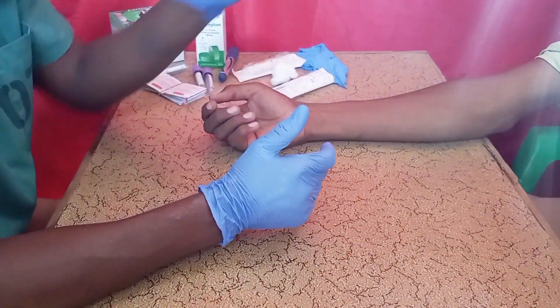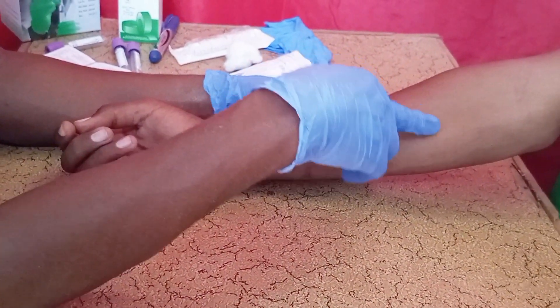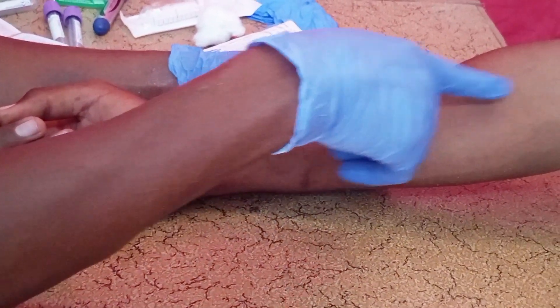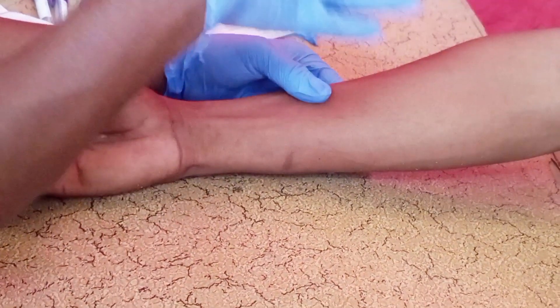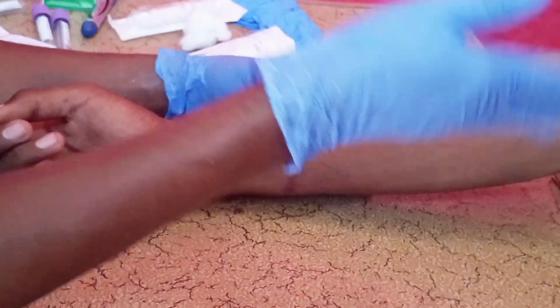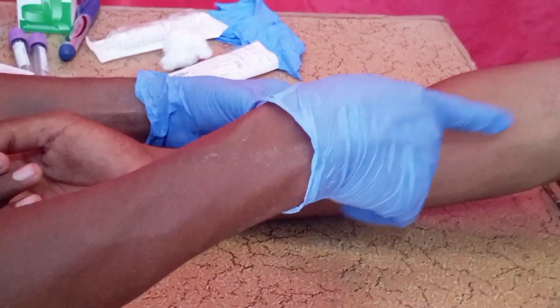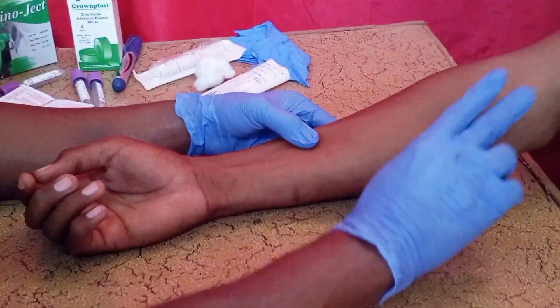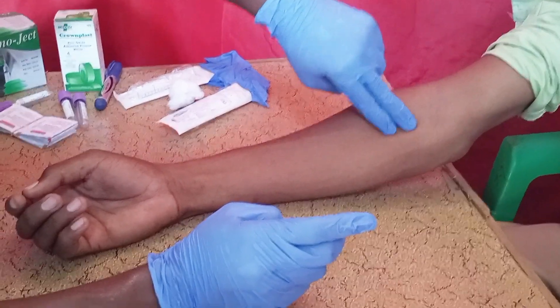You have to select the best and suitable vein. Generally, when taking blood we always select the antecubital vein. As we know, we have the basilic vein, cephalic vein, and the accessory cephalic vein. We always select the most suitable antecubital vein, and you have to palpate it first.